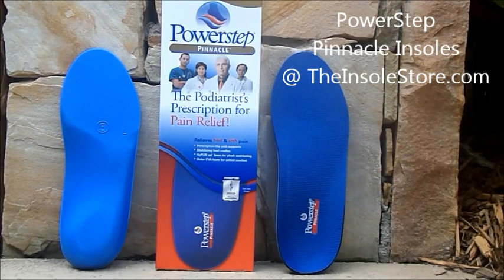Welcome to the insole store where today's featured shoe insoles are the PowerStep Pinnacle insoles. The PowerStep Pinnacle orthotics are ideal for plantar fasciitis, heel spurs, and other foot conditions.